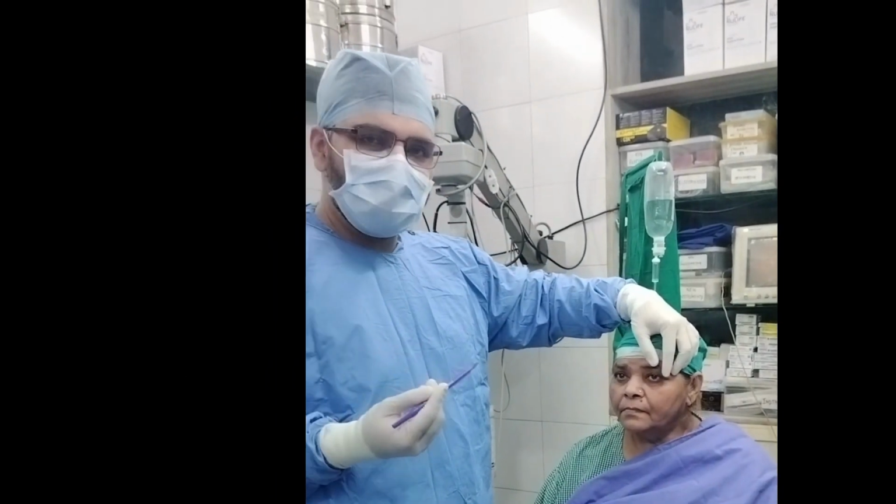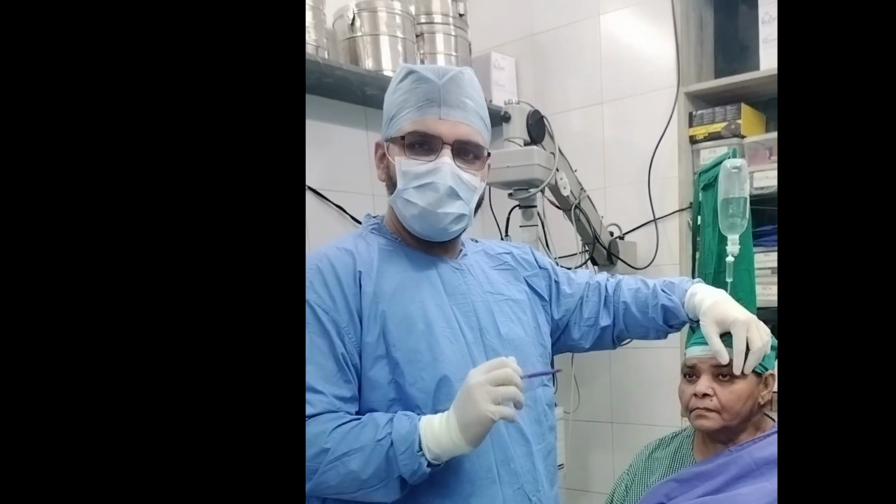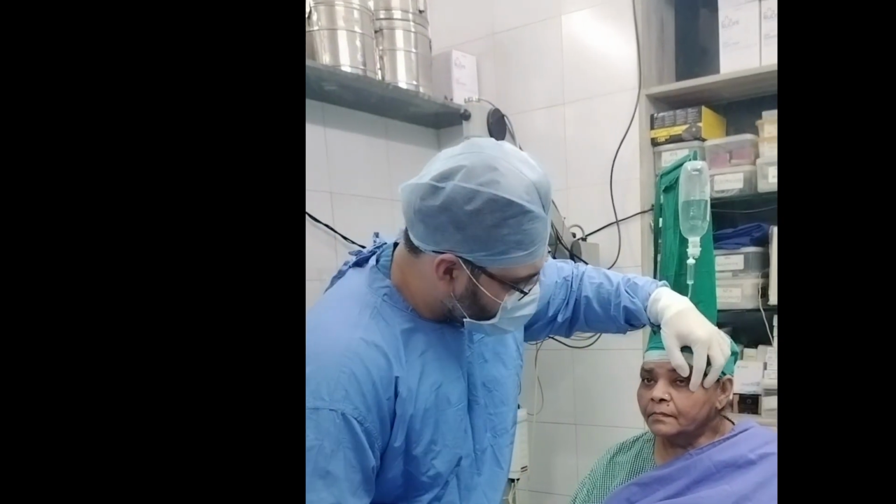So we are going to start by putting a single mark, ink mark in any position at the limbus, which will be detected by the software.